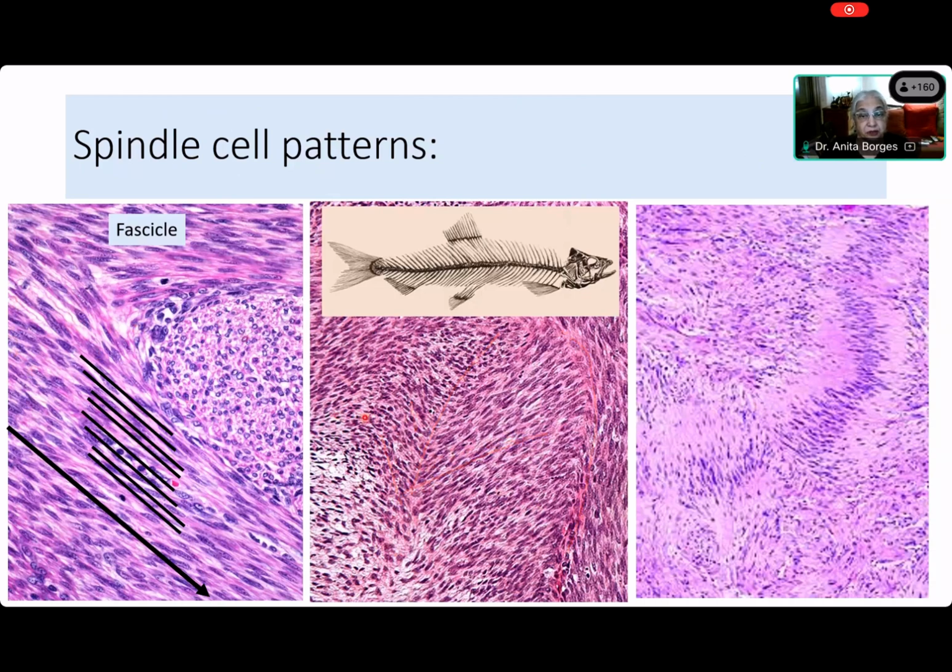Okay. Good. Now I think I have a thing here that you can show. See. So that was the spine of the fish, and these are the deflection of the ribs, which, I mean, they're bones, obviously, of the fish. So that is a herringbone pattern. Now, who's going to take the next? Come on, Aditi. What's this? That is seen. So this is, of course, a herringbone pattern. The next one, Aditi, which is on the right.